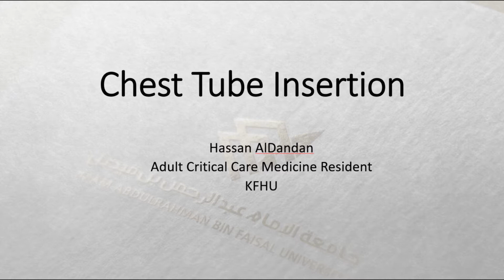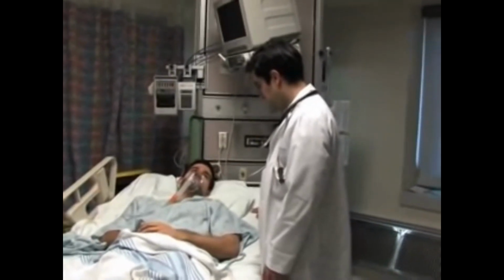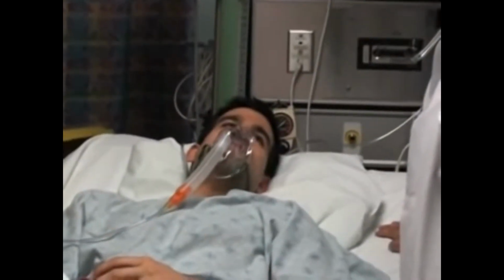Today we will speak about chest tube insertion. The procedure should be explained and consent should be obtained if possible from the patient or their next of kin.